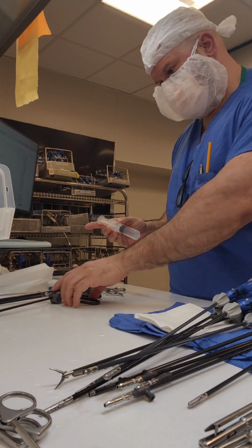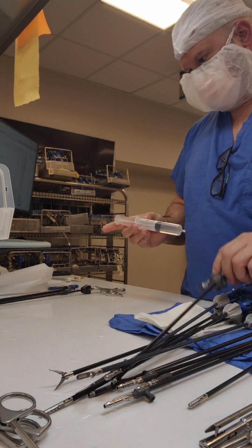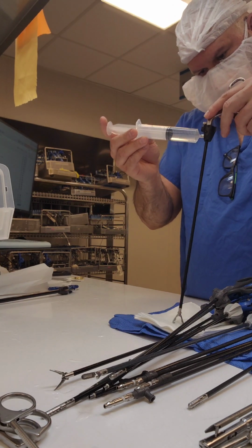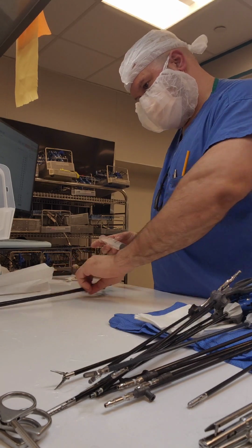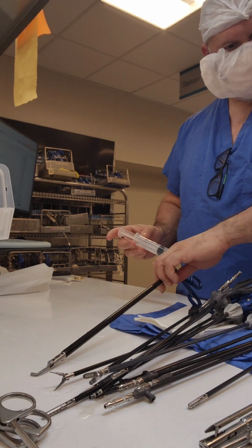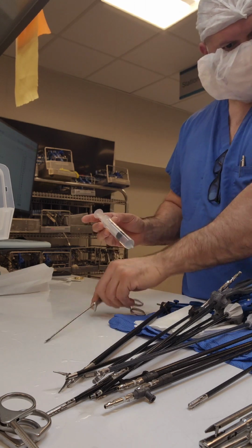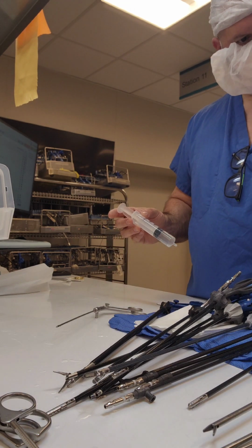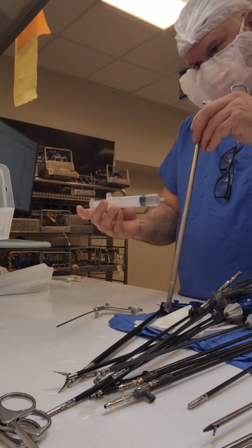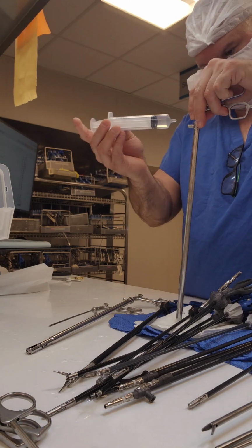The problem with this flushing method is that if there is dried up debris in there, the flushing method isn't going to get that out of there. If there's some dried up debris, I may be able to manipulate my jaw, and you see me manipulating my jaw a little bit. You're going to be able to feel, not see, you're going to feel that this doesn't feel very fluid, something's holding this back. So I went ahead and flushed instruments that are not insulated, because there were other instruments in this set that required some flushing because they have a port on there.